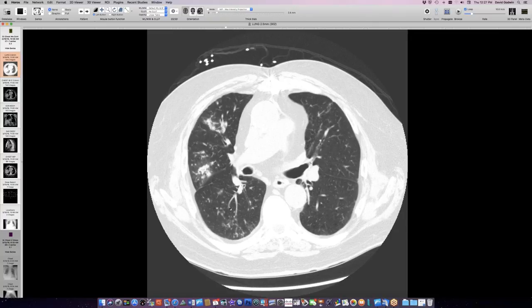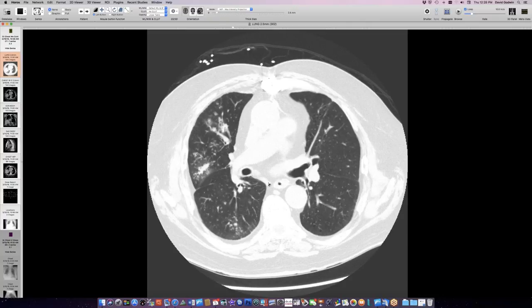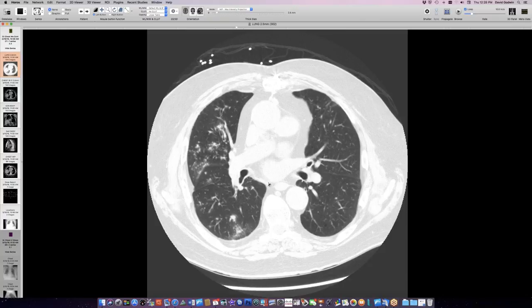This is a typical pattern of aspergillus associated with marijuana smoking, where it really becomes an airways bronchitis-bronchiolitis sort of pattern, typically worse in the upper lungs and spilling into the bases. Marijuana is really important — now that it's legal, it's important to ask people specifically about their use. People don't think of it as a medication and they're not aware of the risks. You definitely don't want to be doing this if you're a transplant person, because this could easily become more invasive when you have a lot of aspergillus in your lung and you're immunocompromised.